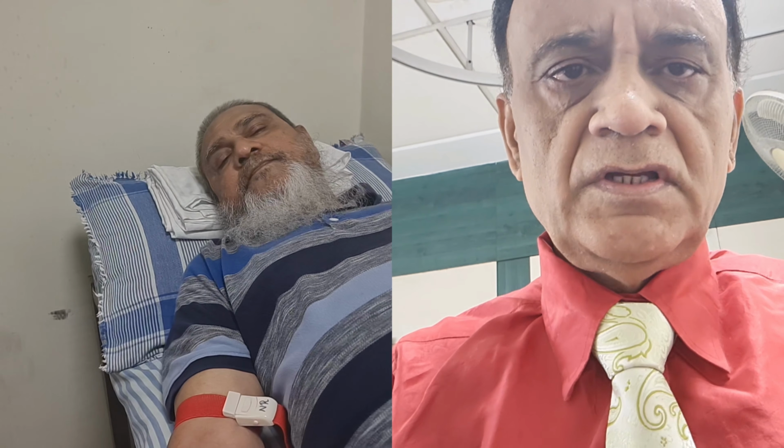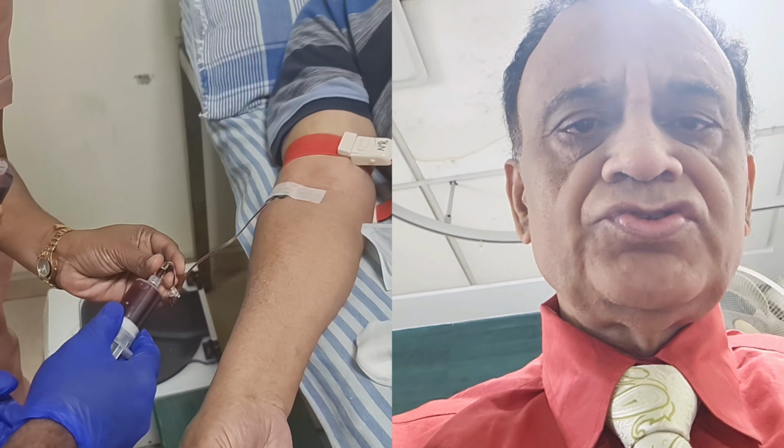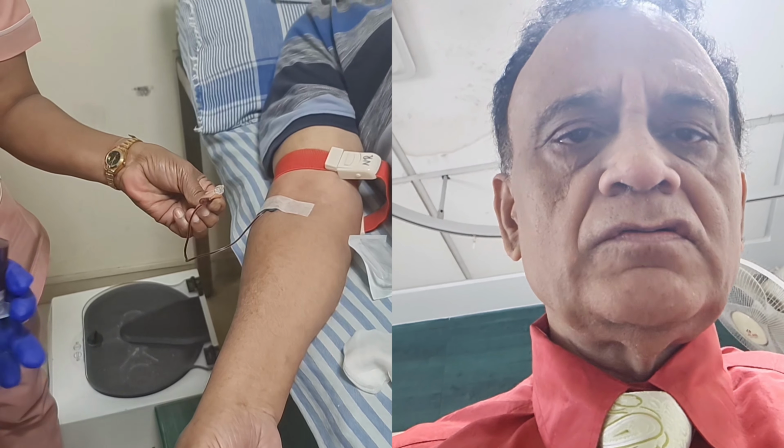This gentleman, Mr. Mohammed Halim, is 70 years old. He has been suffering from knee pain for the last 12 years. So two syringes have been filled up and the blood draw is over now.